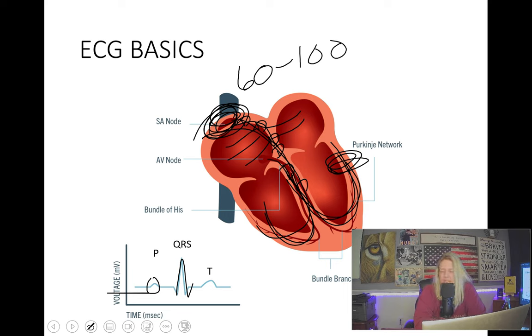But what I don't know is if it's sinus, normal sinus, sinus tach, or sinus Brady. So I have, let me count big boxes. 1, 2, 3, 4, 5. So that's 1 second.